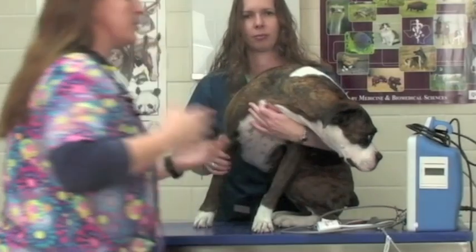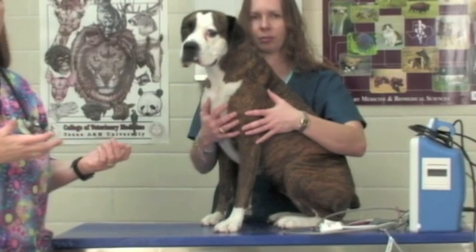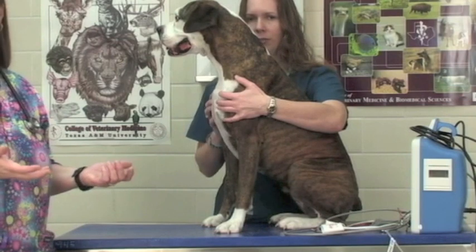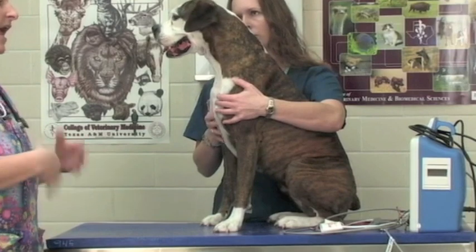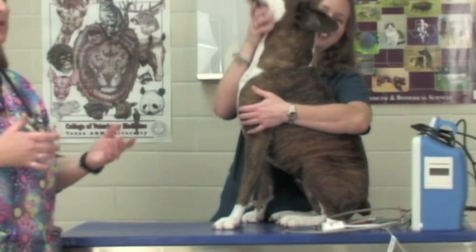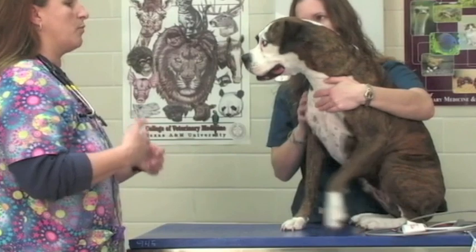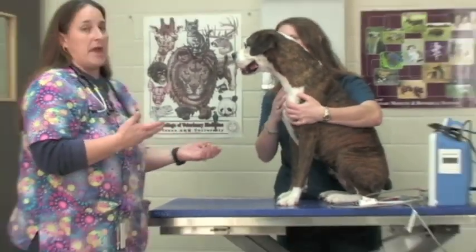Next, we're going to do an ECG and blood pressures. When we do these, we want our patient to be as calm as possible. We lay them down in right lateral and obtain our ECG and our blood pressure. We can do these simultaneously, and that's how I'm going to demonstrate it today. A lot of times we want to get these results as fast as possible, so that we're very efficient and we don't miss anything on our patient. A lot of times, the patient doesn't want to lay in lateral for any length of time, so we want to knock everything out as quickly as possible.